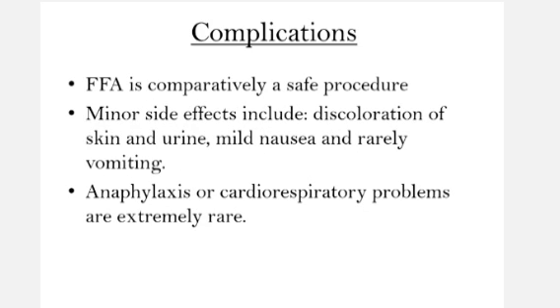What are the complications of fundus fluorescence angiography, FFA? FFA is a comparatively safe procedure. Minor side effects include discoloration of skin and urine, mild nausea and rarely vomiting.